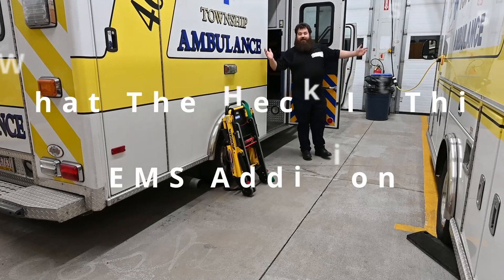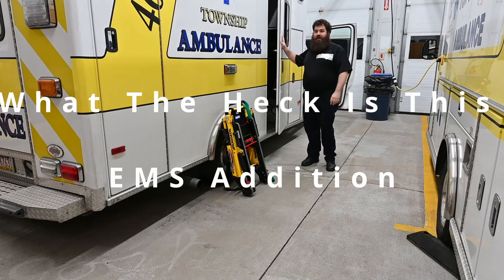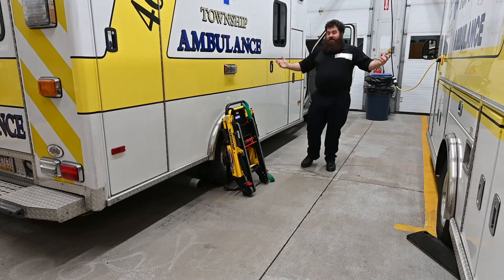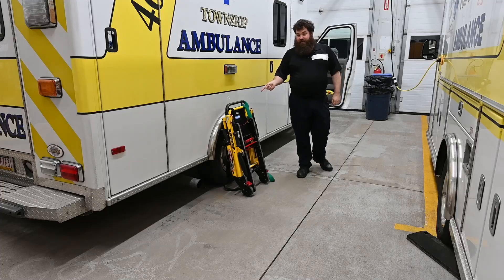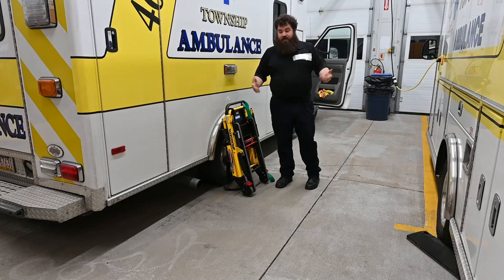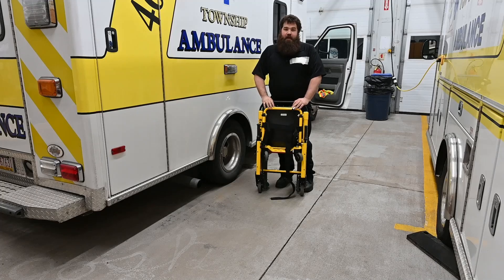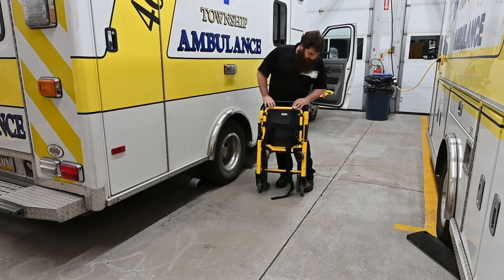Welcome and good evening everyone to the episode of 'What the Heck Is This in EMS.' I don't know what we're going to discuss tonight, but I think it's going to be a stair chair because what's sitting in front of me looks pretty similar to it. So as we continue, we're going to be going over this piece of equipment here — this is what we call a stair chair.